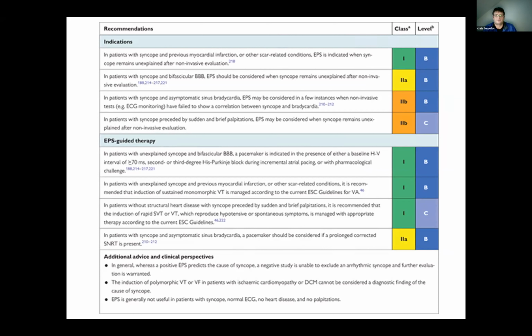I've seen quite a lot more recordings from our patients in the last few years, and it just gives you a little bit more idea. Also, when you're doing your other testing, for example tilt table testing, it's useful if you've got a fairly similar sort of response as well.